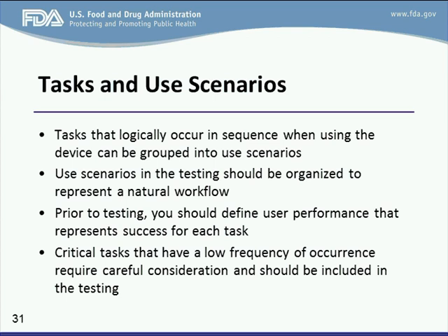Regarding the tasks and use scenarios, you should present the test participants with representative use scenarios. And you can group the tasks into use scenarios in the logical order, and you should present the use scenarios to the test participants following a natural flow.